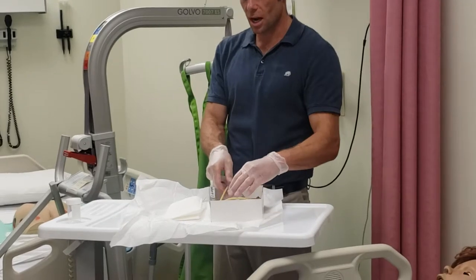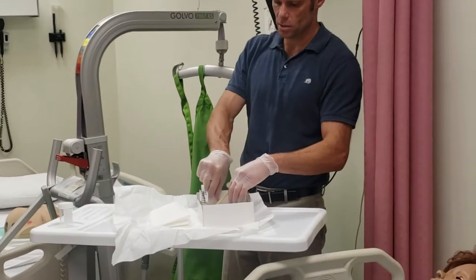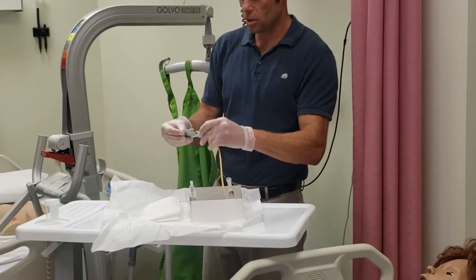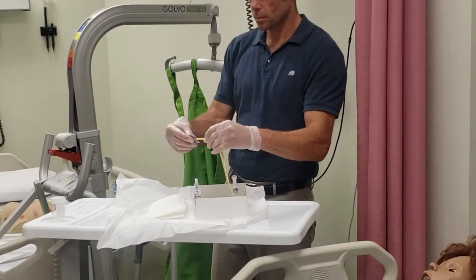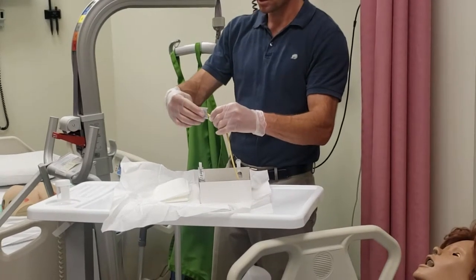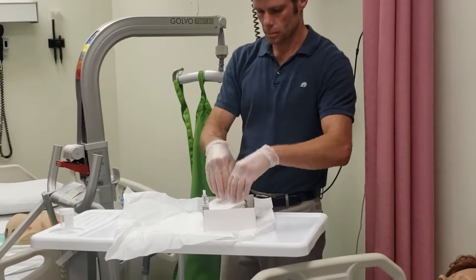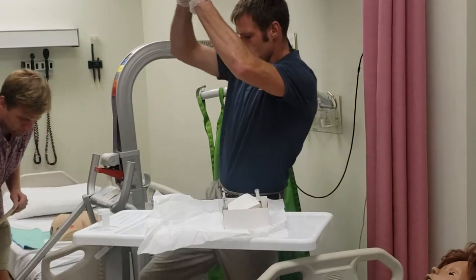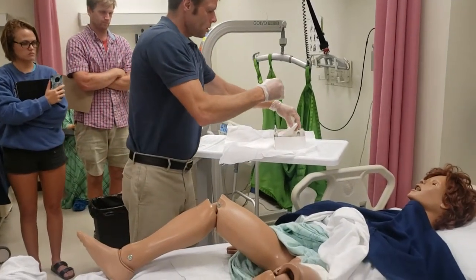With the female catheter, I literally take the catheter — this lubrication area is about two inches. Try not to get lube on your hands; if you do it's not wrong, but it makes it hard to work with everything. Put everything back in like this. Normally you wouldn't have that happen because I'd be standing over here the entire time.